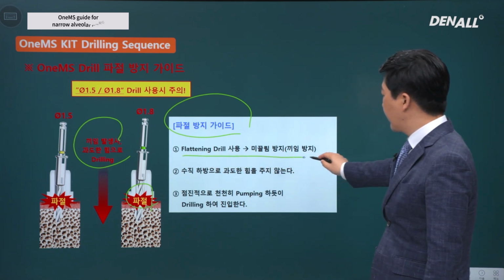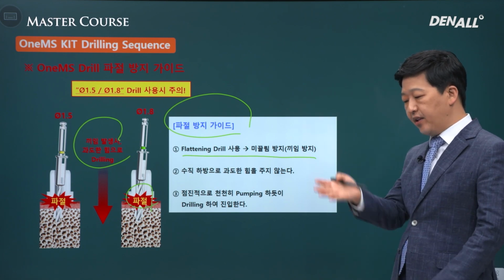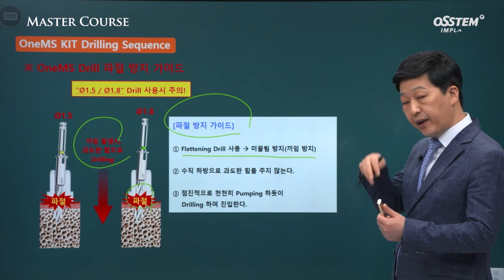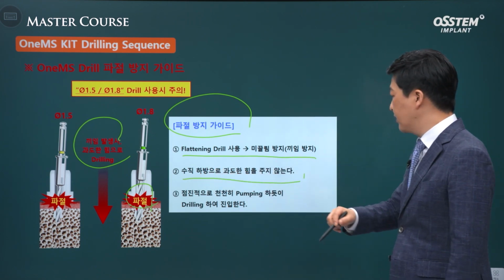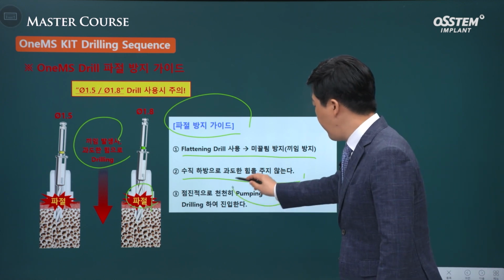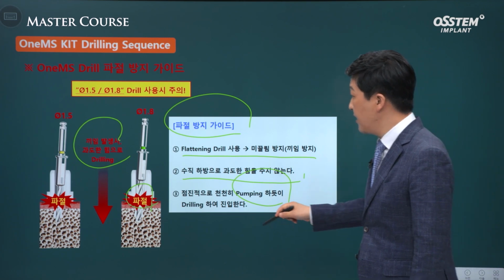You need to use a bone flattening drill first and adjust the cortical bone once. You need to make it flat. You should not apply vertical force excessively. You need to drill gradually, almost as if doing a pumping action.